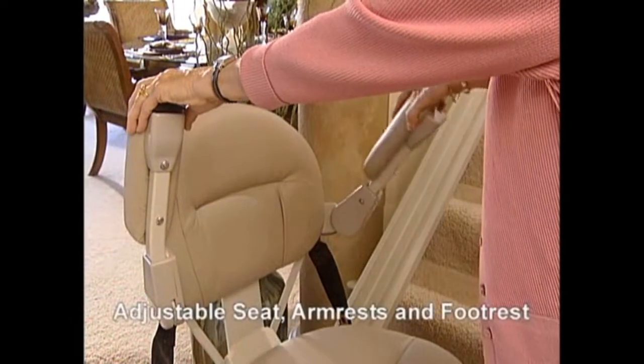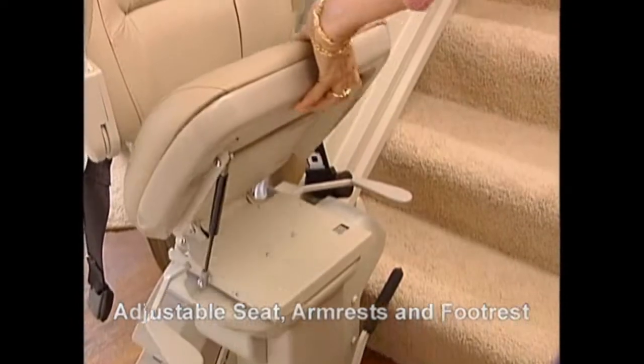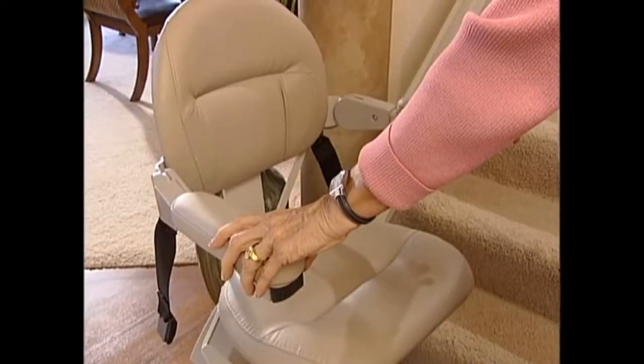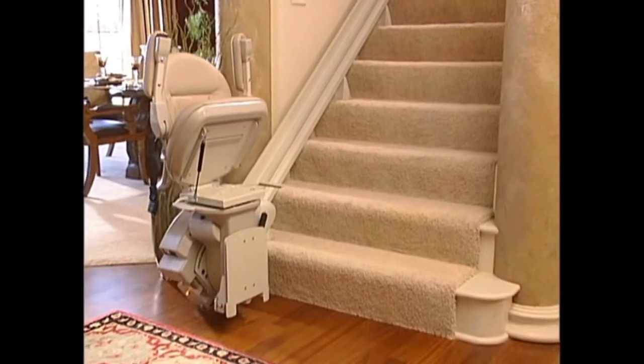The seat height, footrest height, and armrest width are all adjustable for maximum comfort, and they all flip up for ready access to the stairs. The armrest can even be independently flipped up, allowing an easy transfer from a personal mobility device, completing the unit's array of flexible features.